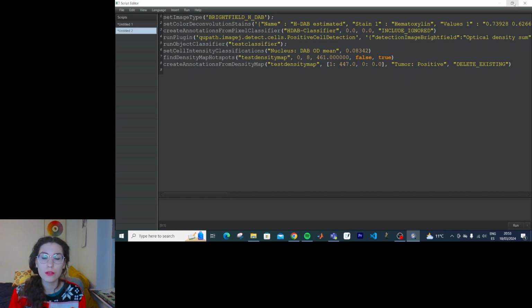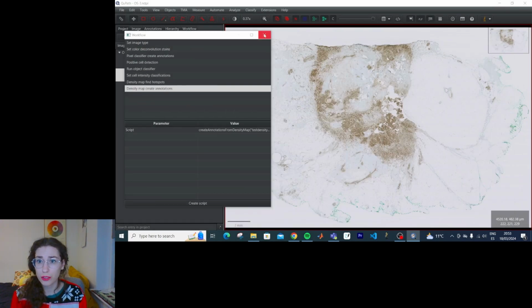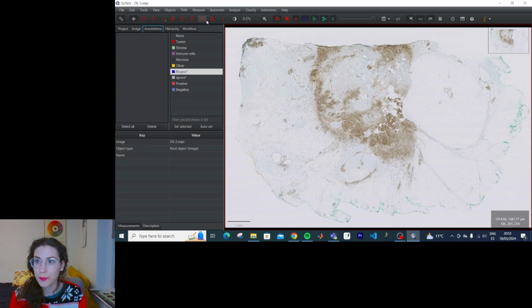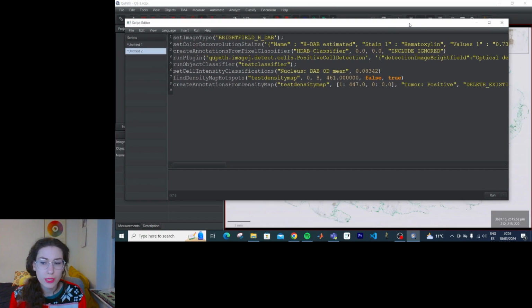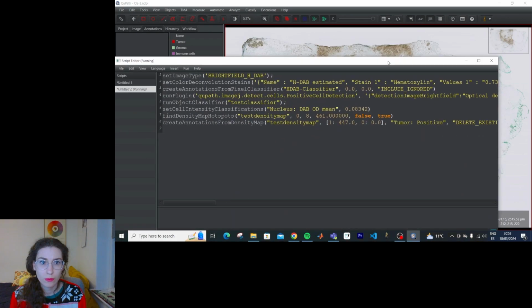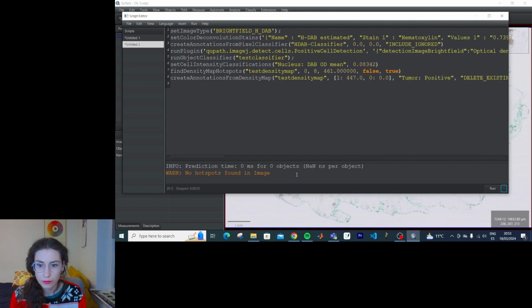Okay, so if we wanted to do the exact same thing that we did with the other one, we're still going to need some manual steps, which are those to do with annotations. So I'm going to create quickly here the annotations that we're going to need for this to work. I think what would happen if I say run and I haven't done the things that I need to do? It doesn't work. It's not giving me an error or anything, but it doesn't work.